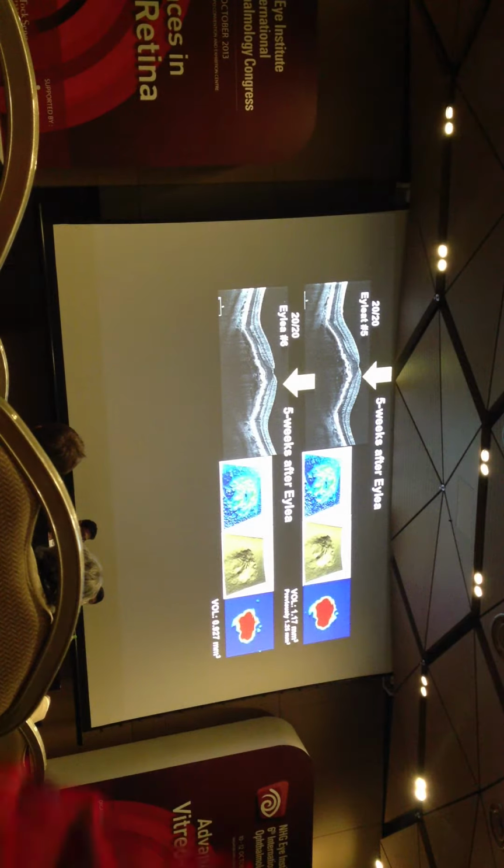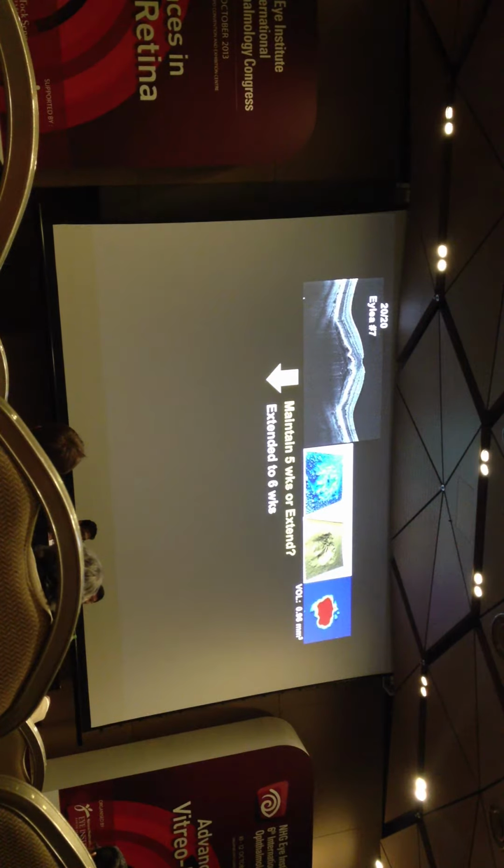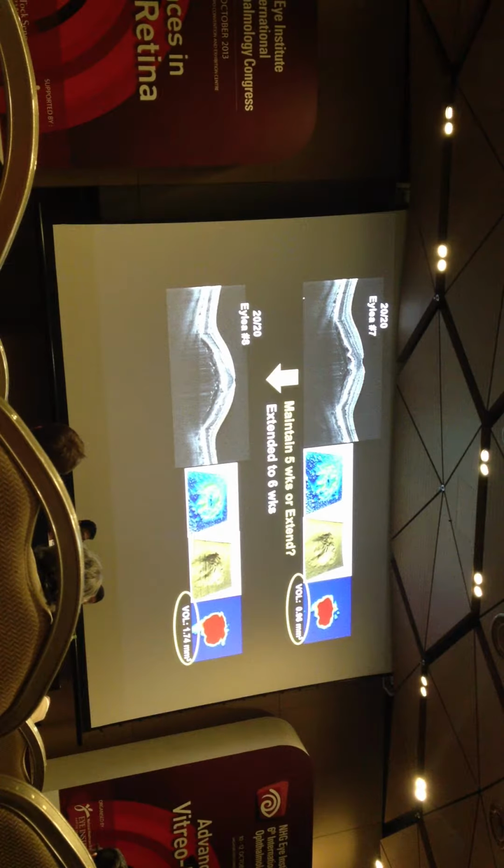Looking good, dropping a little bit, 5 weeks, 0.92, 0.93, 0.96, maybe it's about the same. So maintain 5 weeks or extend. I think I'll extend to 6 weeks. That PED volume just jumped up, 1.74. Not a good sign. What's the next step? Drop it back to 4 weeks.